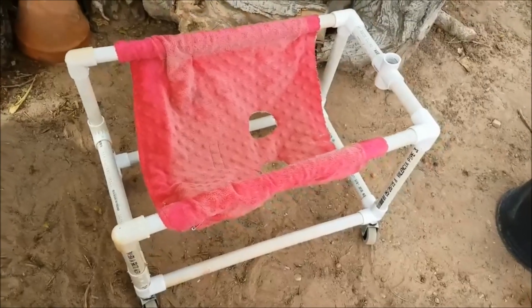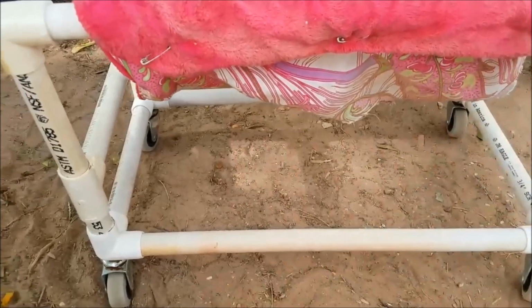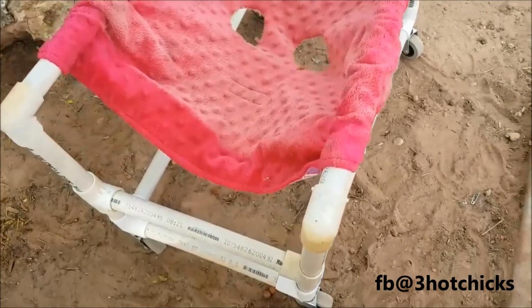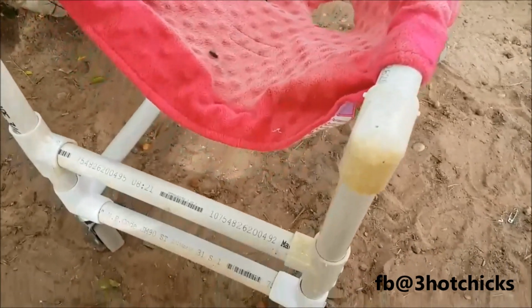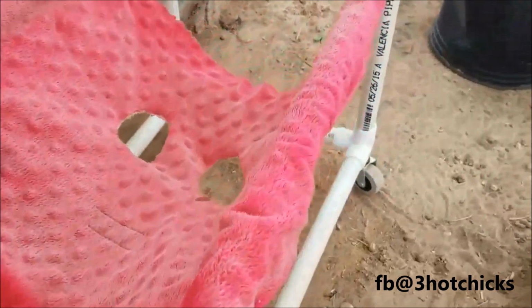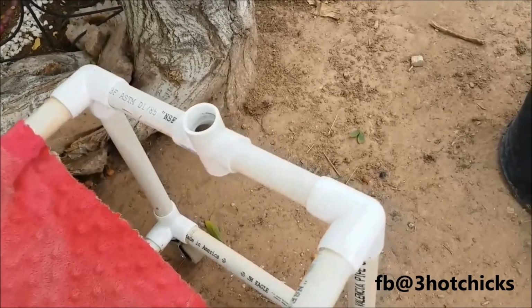That's it all put together. So again, you've got your four length pieces right here. You need those four pieces to be the same. Top and the bottom, four of them. And then you've got two-way fittings there. And you've got two T fittings there. And then you've got your three-way fittings, so two in the front, two in the bottom back, and two on the top. So that's 6 three-way fittings.